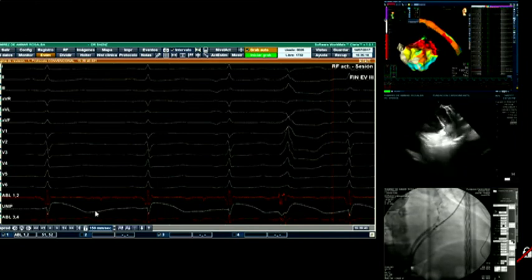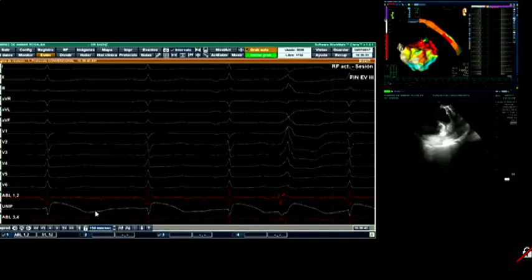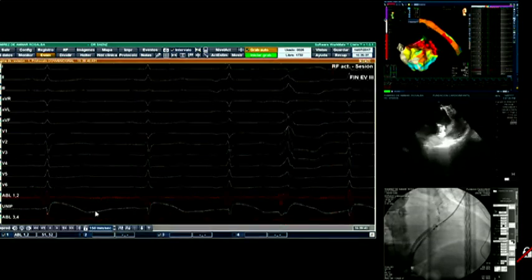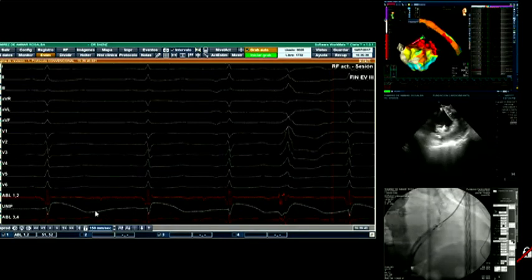What happens is that when manipulating the catheter, it was very difficult for us to reach this point. And we got there and we got the pacing or the activation, and then we ablated. But we were ready for the transeptal approach, because you're very right. If we had done a curve, probably we would have better opportunity to come to this side than doing the retrograde.